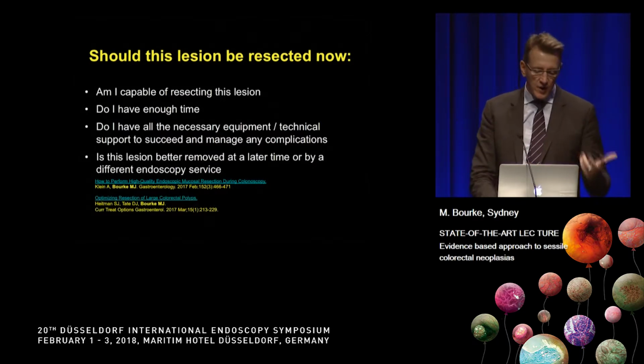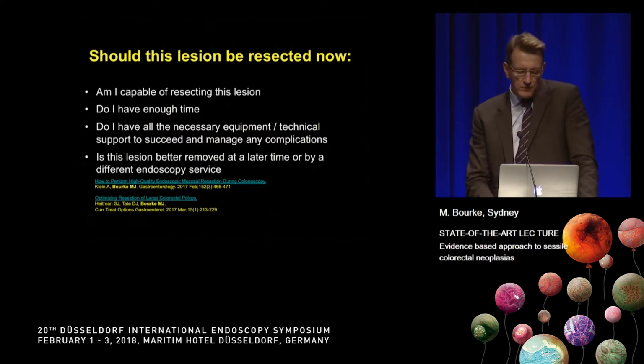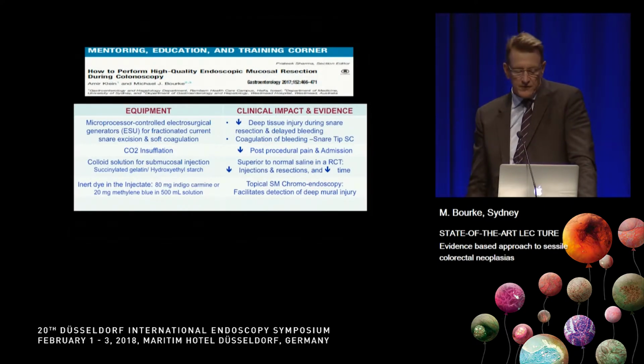Then you need to think, can I do this now, or should we bring this patient back? And do I have all the equipment that I need? Do I have enough time? Time's important. You don't want to be under pressure of time. And is this lesion better removed at a later date by a different team or another endoscopist?